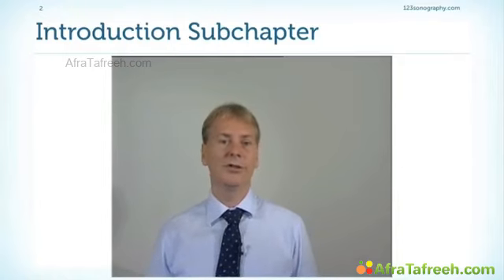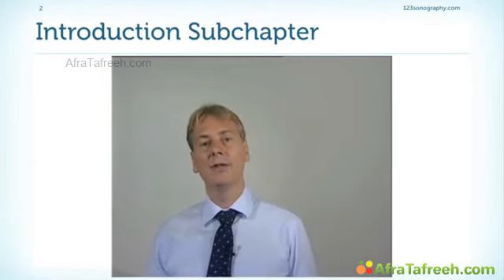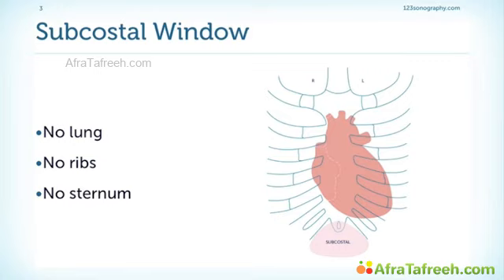The subcostal window works on almost all patients. I think it should be an important component of every exam, and you will learn that in special clinical situations, this view is extremely helpful. Where is the subcostal window located?